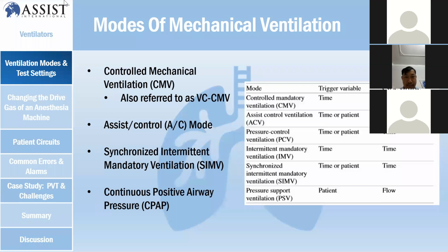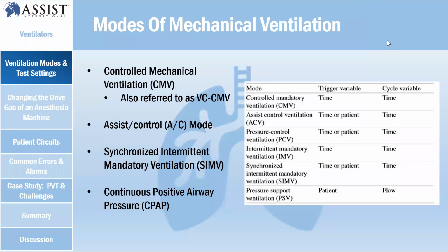Hi, everyone. So we're going to talk about ventilator details today. First thing, you need to know your mode of ventilator.